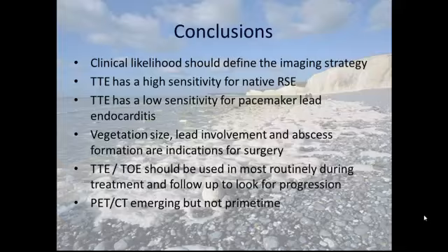And finally, PET-CT is an interesting tool, but it is really not prime time except in selected cases at present.